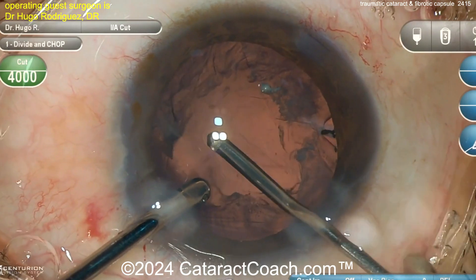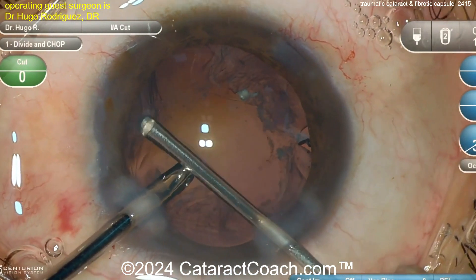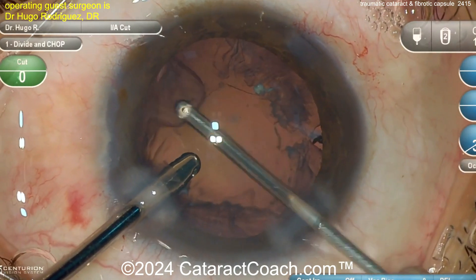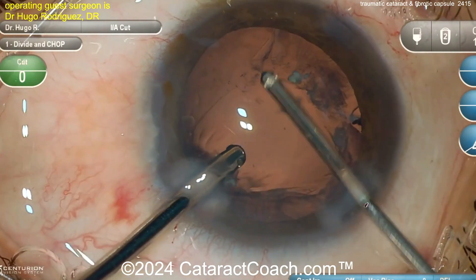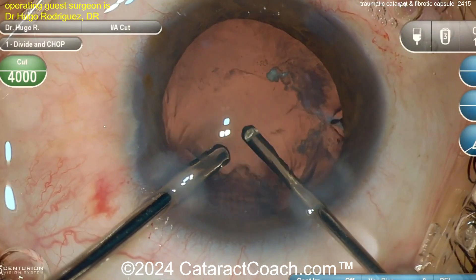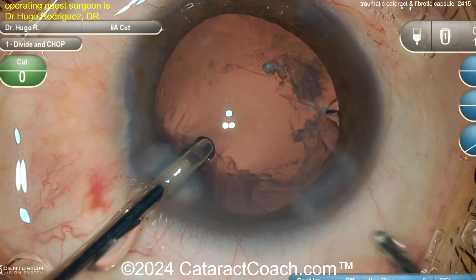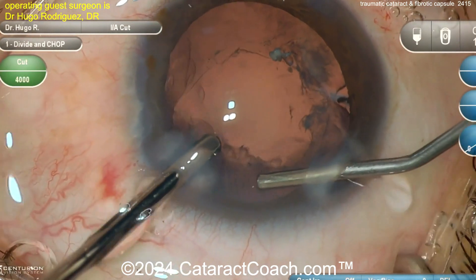Taking out some of that lens cortex — you can again use the bimanual I/A. Here's a pro tip on the machine settings: go to cortex removal I/A mode, and then even though you're using the vitrector it won't engage the cutter. That's important here. So when you clean all this up, switch hands maybe and get a little bit different access.